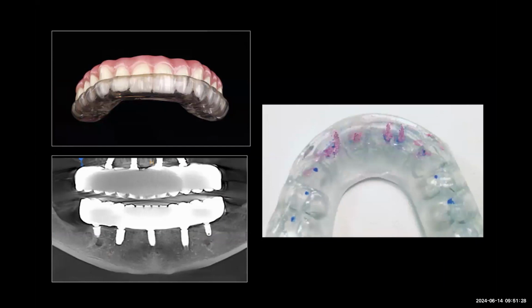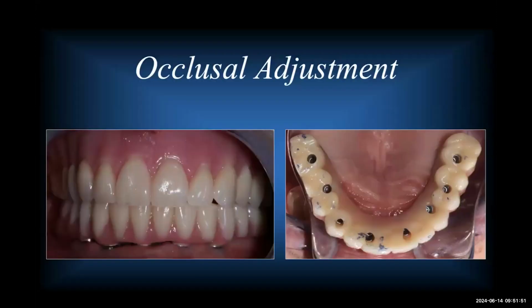Now, who should have an occlusal guard? Number one, it's going to be a patient who has parafunction, definitely. And I would almost go to say when patients have implants against implants, even without parafunction, it's not a bad idea to have an occlusal guard. They work, they take the stress, especially if the patient does clench or brux.